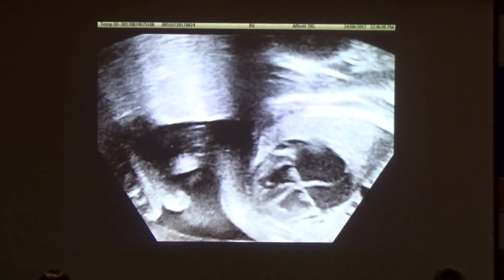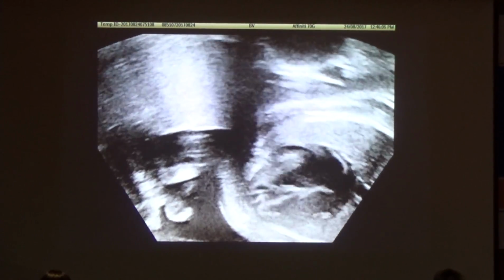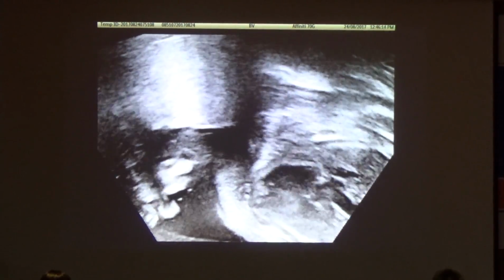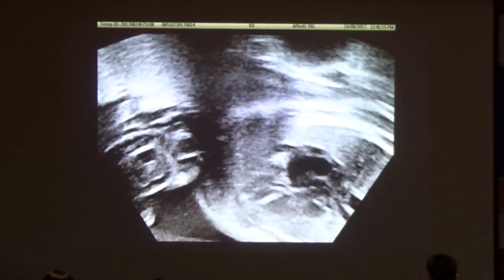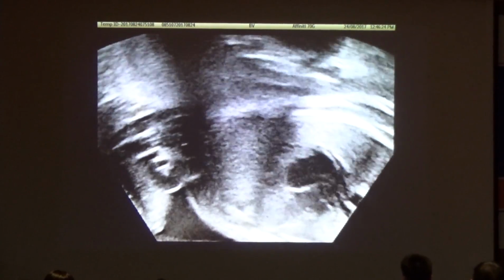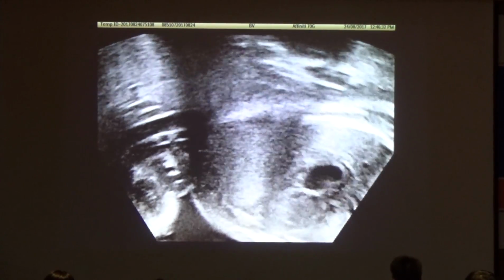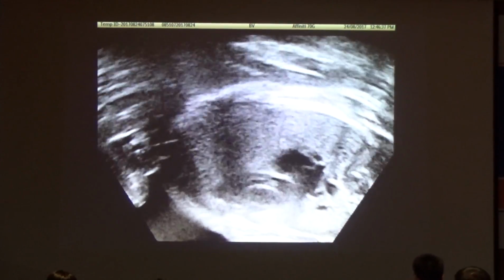What worries me about big pulmonary arteries is, the pulmonary artery is big, where's the aorta? Where's the ascending aorta? We saw it's much smaller. Why should the aorta be smaller than the pulmonary artery? They should be about the same size in transposition, but there's a disparity of size between the aorta and the pulmonary artery. We have not yet seen the aortic arch, right?